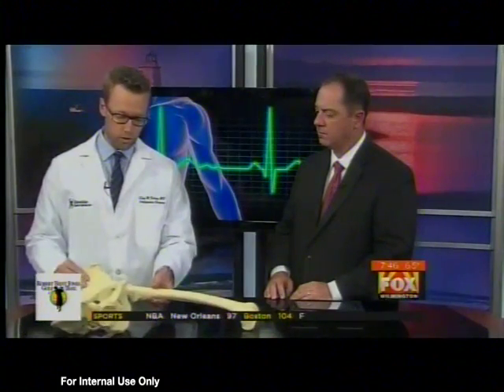So hip arthroscopy is a minimally invasive type of surgery, and it's done through 2 or 3 tiny incisions, no bigger than the width of your fingernail. Yeah, that's the part that blew me away. And it allows us to get access to your hip joint, which historically is a very deep-seated joint in the body and difficult to get access to. But with the advent of improved technology, improved equipment, improved techniques, we can safely access the hip joint now with these small, minimally invasive incisions.